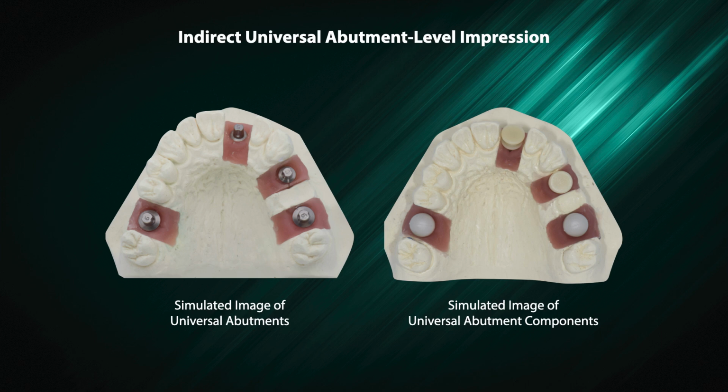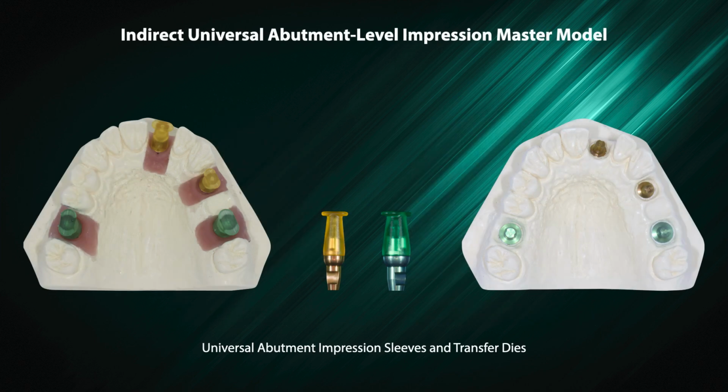Indirect universal abutment level impression. On the left is a simulated image of universal abutments, and on the right is a simulated image of universal abutment components. Indirect universal abutment level impression master model. Seen here are both universal abutment impression sleeves and transfer dies.